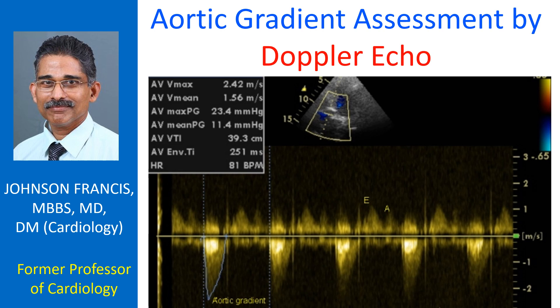In this image, measurement of aortic peak gradient and mean gradient are illustrated. The early diastolic E and late diastolic A waves of mitral inflow are also demonstrated. Peak aortic gradient and mean aortic gradient are mildly elevated in this case.